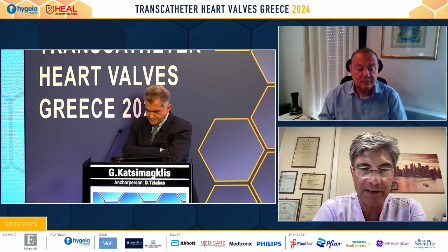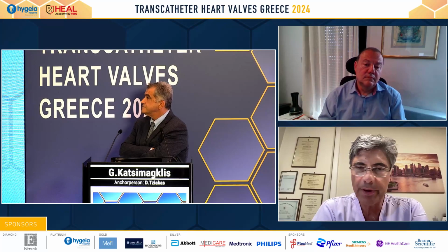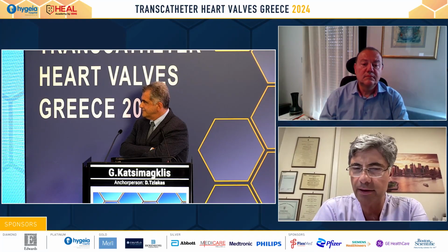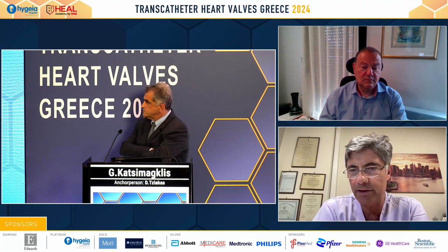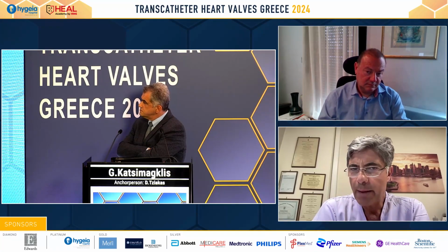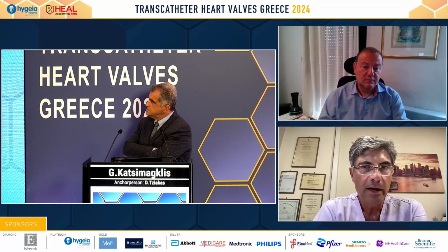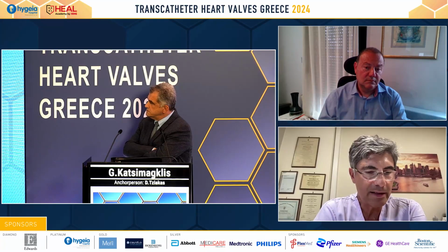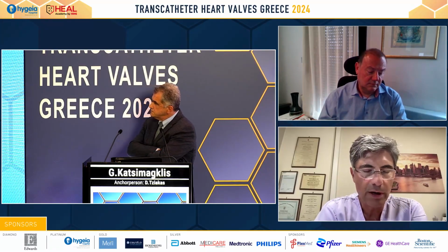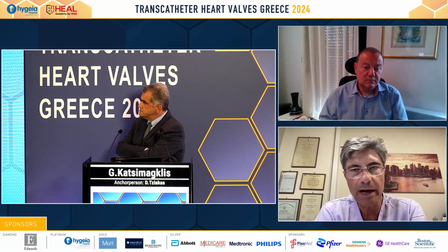I agree that after a certain period, this is something unavoidable. When you do more and more cases, you end up with a certain number of these cases. It's less than 1%. Now we have 0.3% in our practice. I think it's very important what you said on the meticulous study of the CT. But also a couple of things that I would like to point out is we should be generous when in doubt to pre-dilate, especially in the non-calcified valves, and also, as you said before, it's very important to pay special attention when we retrieve the nose cone of the self-expanding valves. This is where we have the problems.